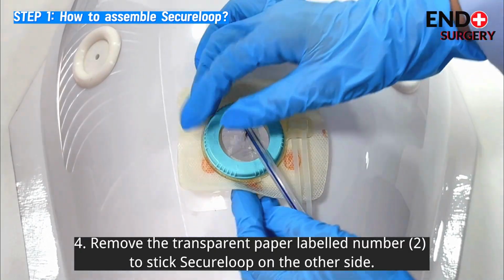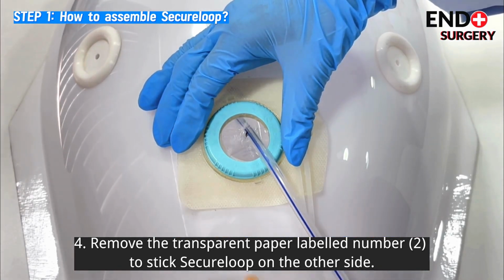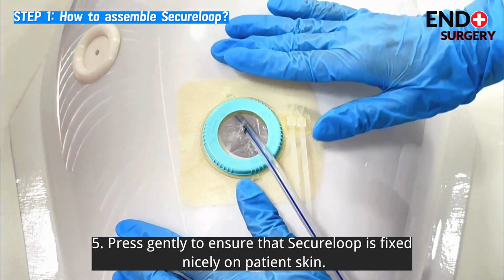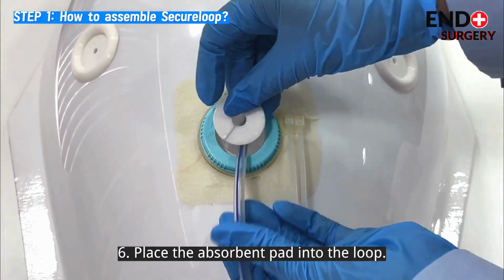4. Remove the transparent paper labeled number 2 to stick SecureLoop on the other side. 5. Press gently to ensure that SecureLoop is fixed nicely on patient skin. 6. Place the absorbent pad into the loop.